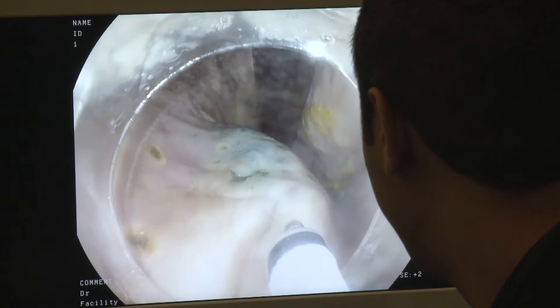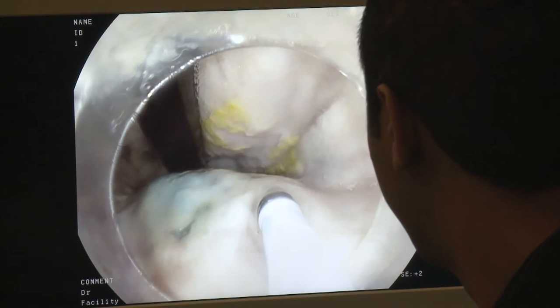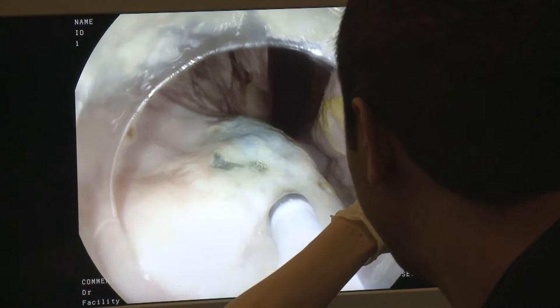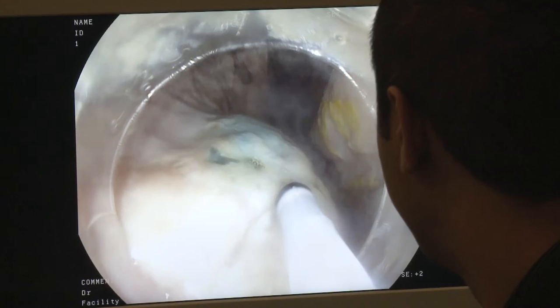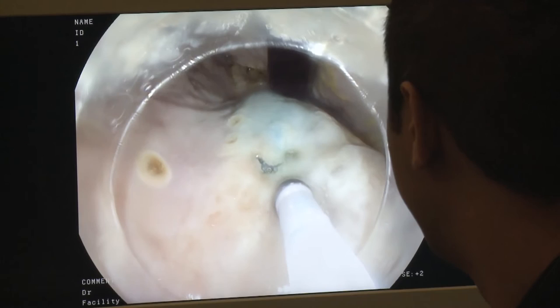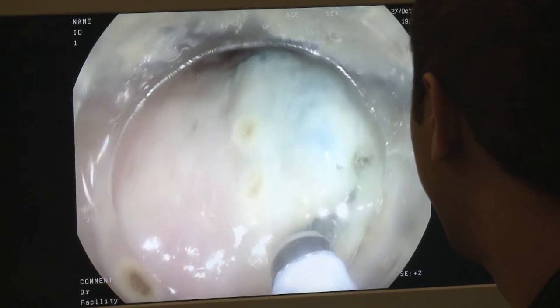Hook the tip of the needle here. Mark the lesion. We will be away from the mucosa, from here to go away, this bed. More, push harder, like this, more and more. A little bit down. From here. Put cut. Cut. Yes, that's okay.